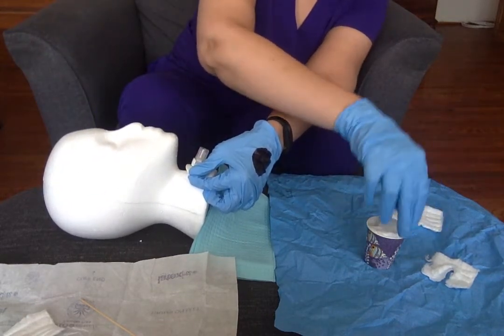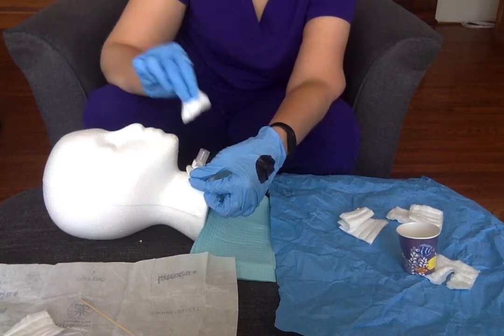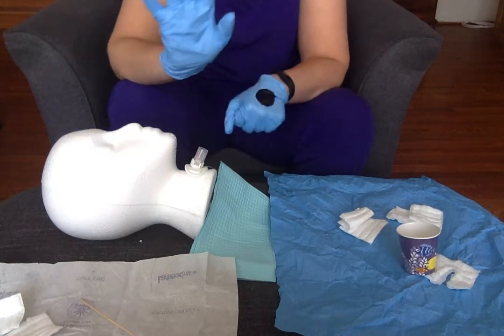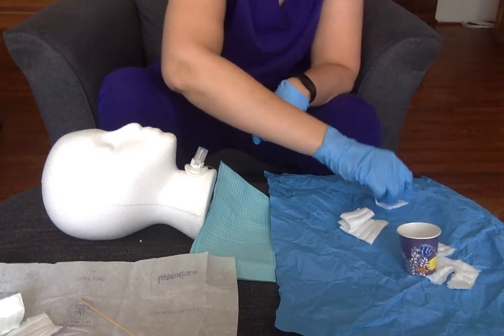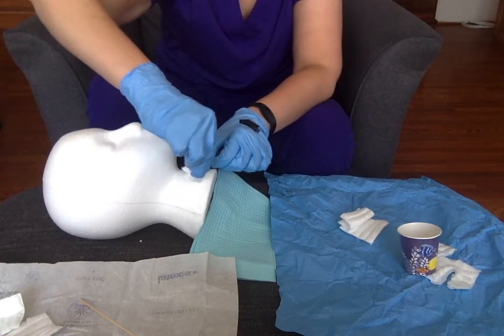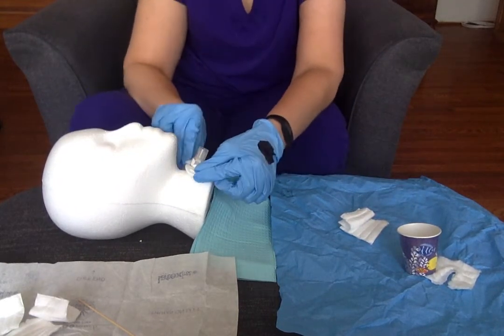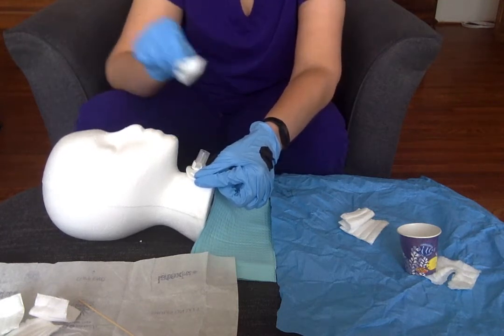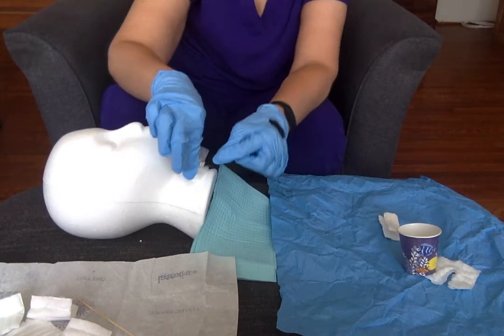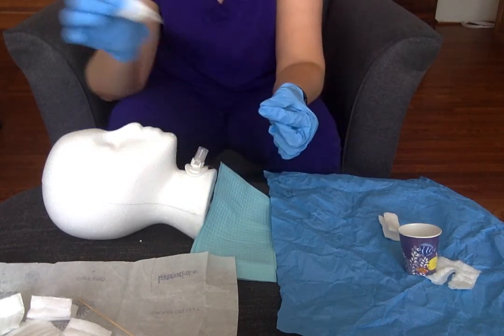I can pick up another saline-moistened gauze and use it to clean the top of this face plate — that goes in the trash. Now I want to grab my dry gauze. I've got to clean underneath first, stabilizing with this hand and cleaning with this one to dry. I grab another one and dry underneath the other side. Then I use another one to blot the top of the face plate dry as well. We don't want any extra moisture because it's a risk for skin breakdown for your patient.